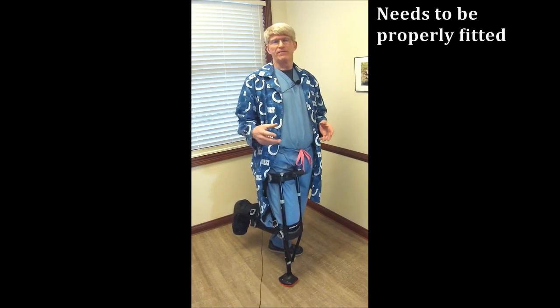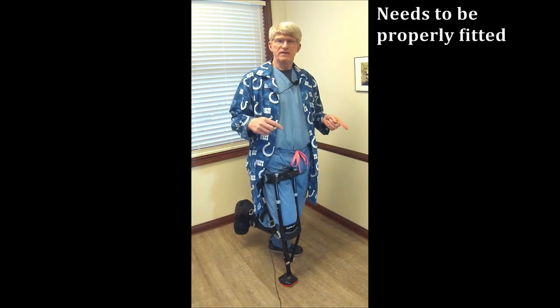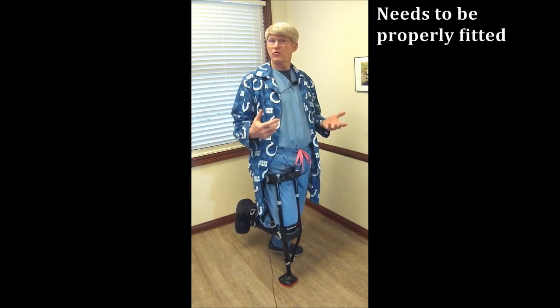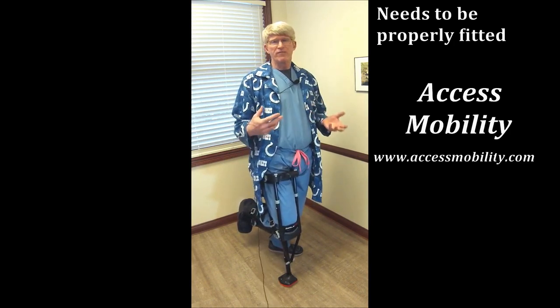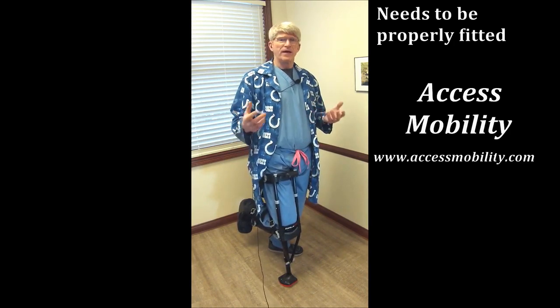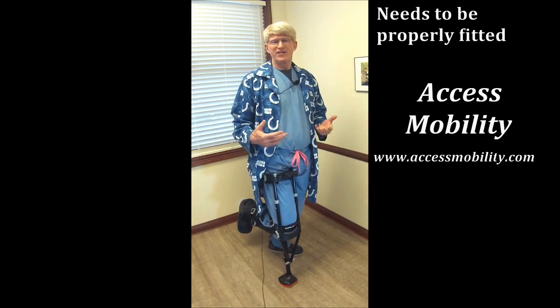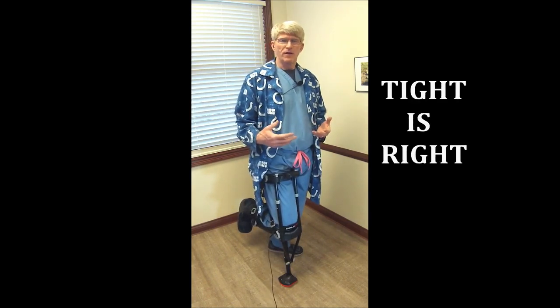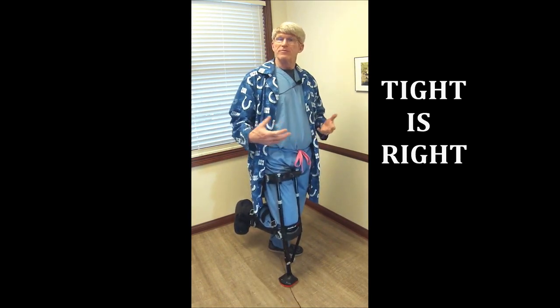The critical thing with this is fitting, and I highly, highly recommend that you go to a specific fitting center for this. The local one is in Beach Grove — it's called Access Mobility, and they're very, very good with that. I stay away from online sales, the internet, eBay. You may save $5 or $10, but you won't get fitted properly, and that's what makes this thing really, really work. With this, remember: tight is right. The tighter the straps, the more secure you are and the better it will work.